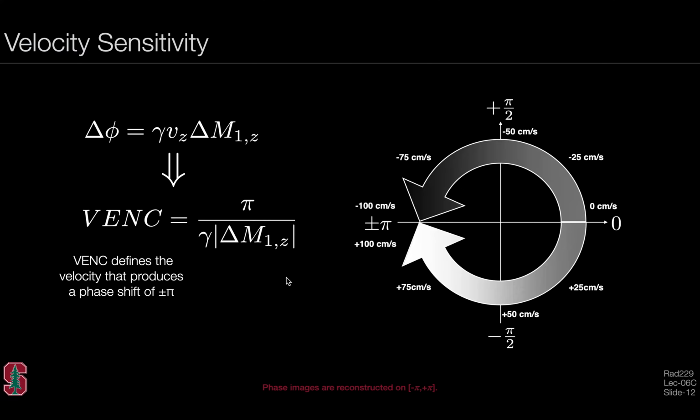And so here we just see a mapping of both phase and velocity. As the phase value for the signal that you're sampling is increasing, it's increasing in terms of, say, centimeters per second, but also in terms of, say, pi, until at some point, if we go clockwise and counterclockwise, there's a point at which they measure the same, plus or minus pi, but at the same time, those are very different velocities, right?